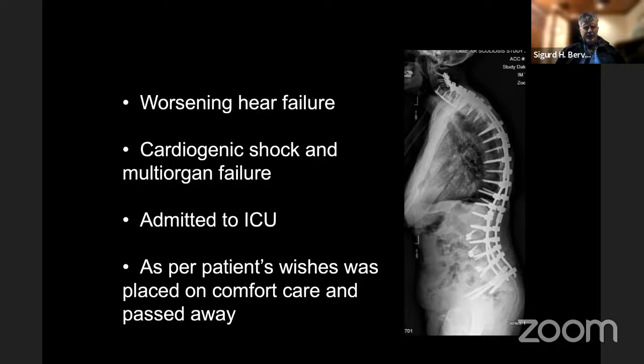The progression of her deformity is difficult. These cases are very difficult for adjacent segments. There's a lot of demand on the implants here, as somebody who's progressively losing muscular control. In her case, she was actually doing as well as she's ever been in many, many years. The last time we saw her in clinic was about 4 months ago. And as Astra was presenting this, we knew at that time that she was having some cardiogenic failure related to her myopathy. And unfortunately, we found out that she just passed recently.